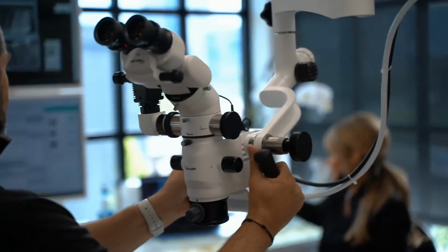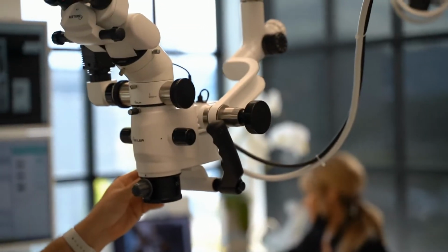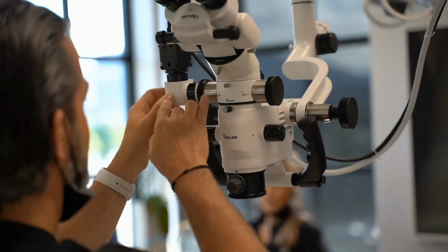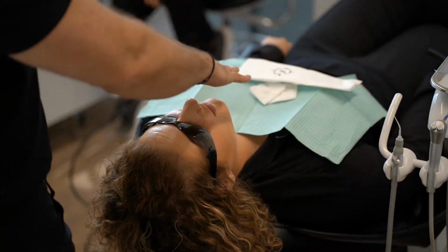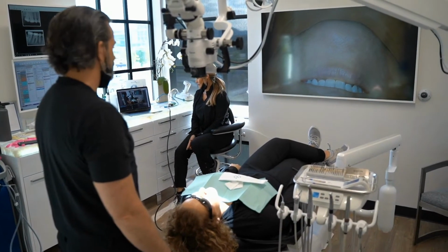So for instance, as a talking point, I have this spot. This is not practical to keep in focus like so. But what if I'm wanting to talk about something and show this camera, show my screen? This is kind of out of focus, but I have a lot more depth of field here than I do here. So this distance is not as affected because of this correction. It gives me the ability to have this extreme distance between me and the patient. Look at that distance, we've got about 2.5 feet here. There you go, and I'm in focus.